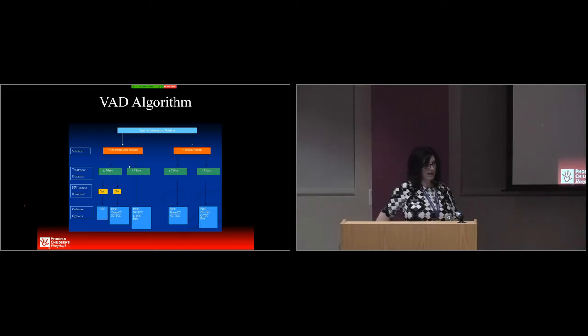If you are not giving an irritant or vesicant and you need access for less than 7 days, you can go with the peripheral IV. If they don't have access, then you'd go on to other central access. So again, you can use this in the venous access order to help determine what catheter is best for the patient. And then also, depending upon what's infusing, if you're doing TPN and lipids, then we'd place a dual lumen line so that you have one line available for other infusions and blood draws.